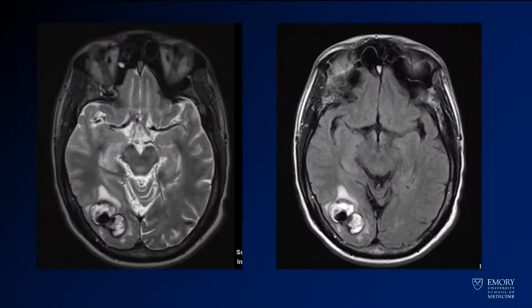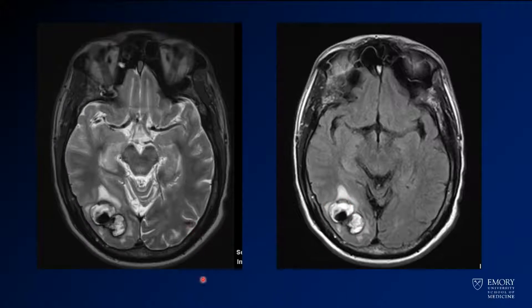Now we're going to take a look at an MR. That biggest hemorrhage in the right occipital lobe — you've got a lot of T2 brightness, kind of a heterogeneous hemorrhage with a little bit of surrounding edema. Maybe a little bit of hemosiderin also back in the left occipital lobe there.